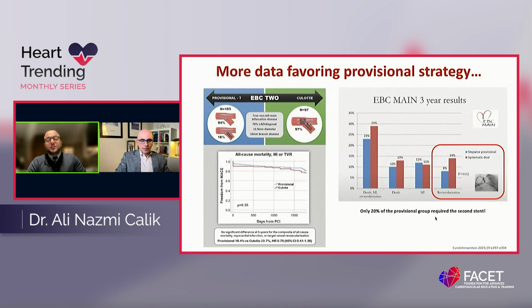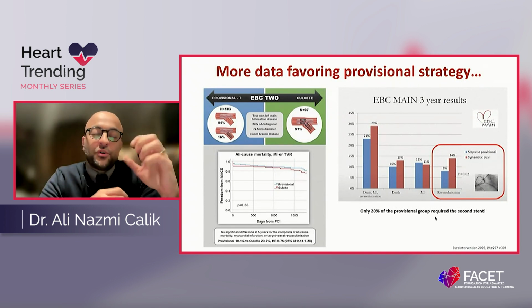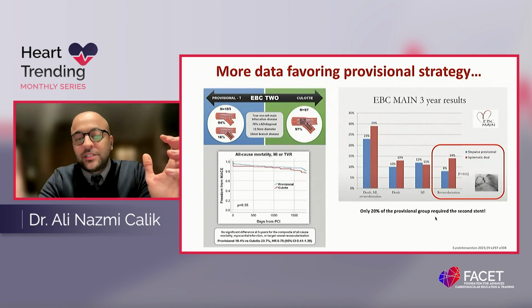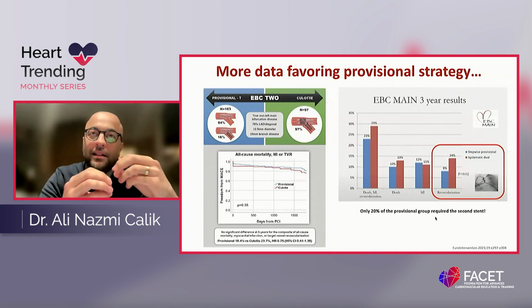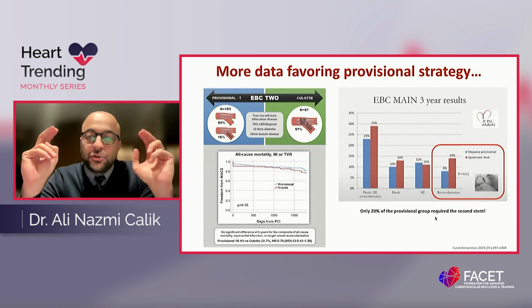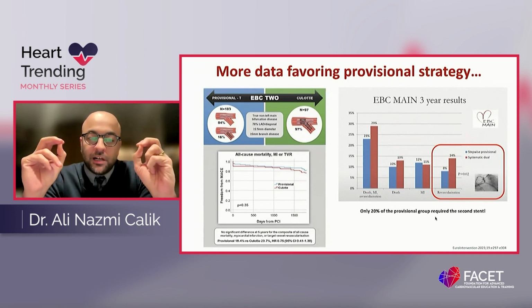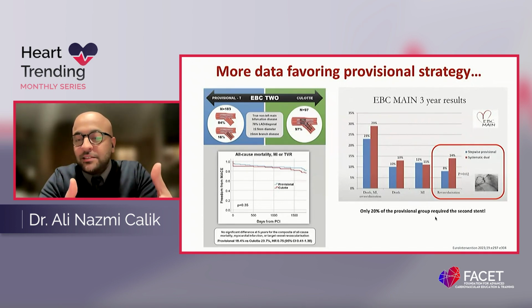So this brings us, Chadi, to a point about cosmetic results while dealing with bifurcation lesions. Of course, when we put the first stent from the proximal main vessel to the distal main vessel, a crossover stenting, let's say we see an angiographically suboptimal result in the side branch ostium that doesn't affect the flow or the FFR values.